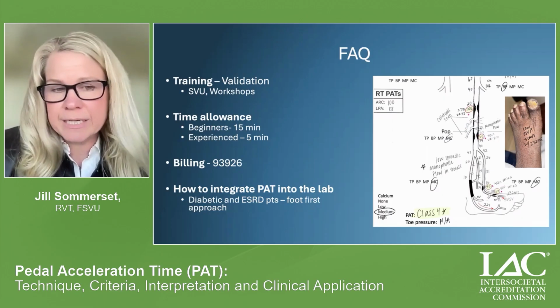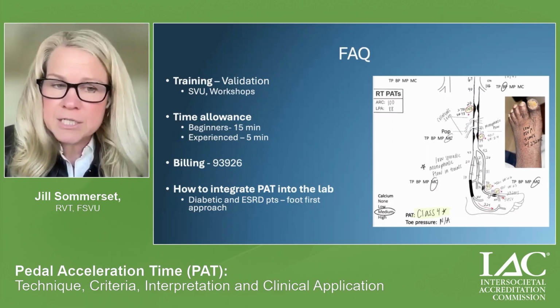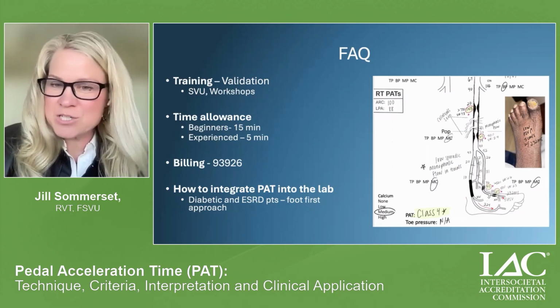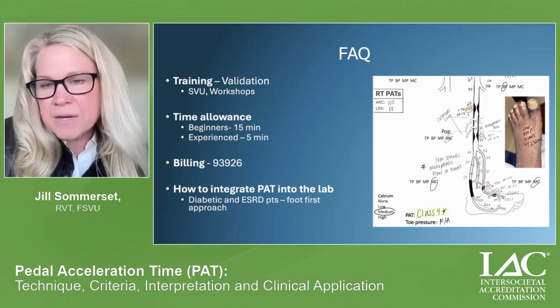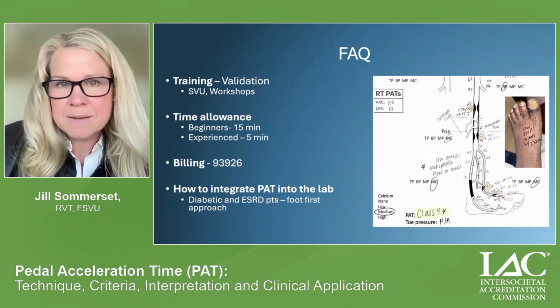And then in regards to integrating into the lab, I think there's a place for it in our diabetic and renal failure patients, but you also have to validate your own vascular technologists in the lab and compare that to your ABIs or toe pressures. But there is certainly a role for integrating this nicely in complex patients.